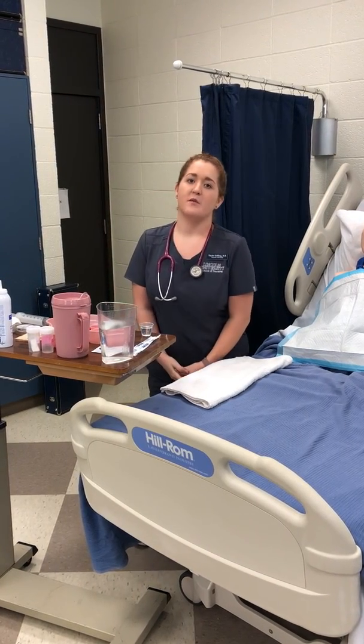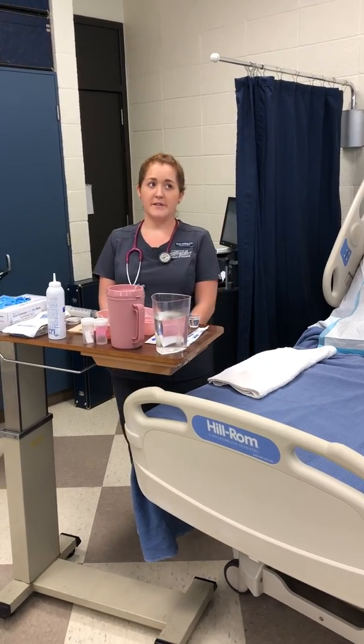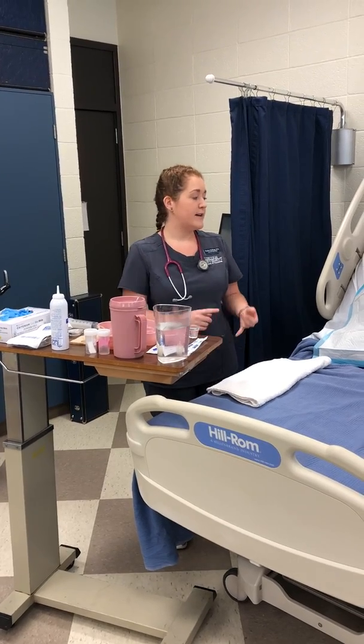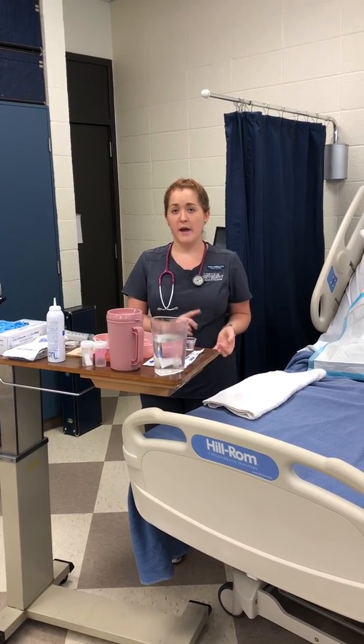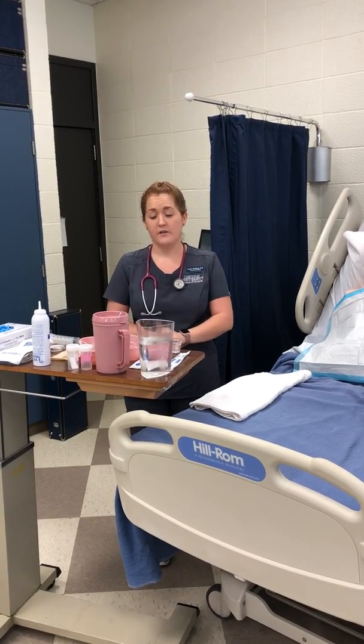Hello, my name is Taylor Erfling. I'm a four-semester nursing student at Lincoln University. Today is September 26th and the time is 9:40 in the morning. Today I'm going to be showing you how to insert a nasogastric tube, administer two medications through it, and then how to remove it as well.